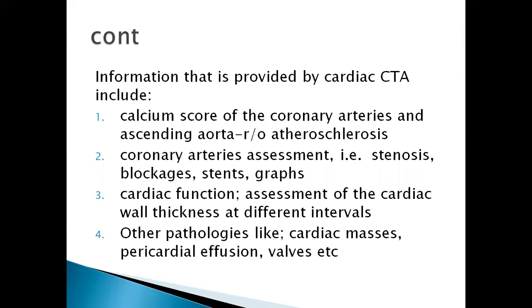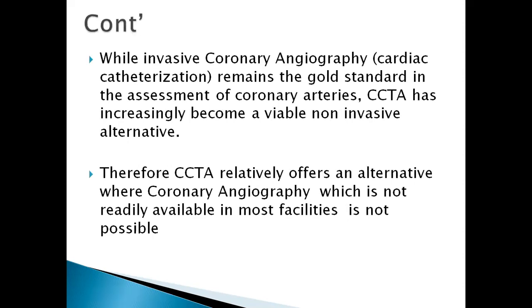If stents or any grafts were previously put in, then you can check them and make sure whether they are patent or not. Apart from this, cardiac function can also be assessed with this same examination, where you will check the different wall thicknesses at different levels. We're going to see this as we go down. As you do this, you may have incidental findings like cardiac masses, pericardial effusion. You may also pick out valvular pathologies as you are doing this examination.